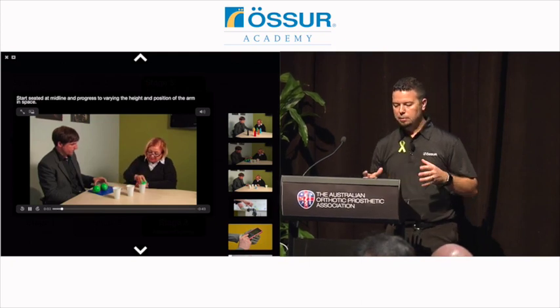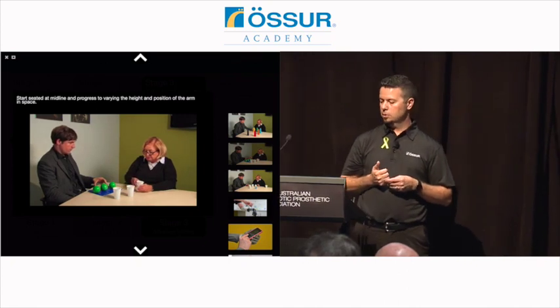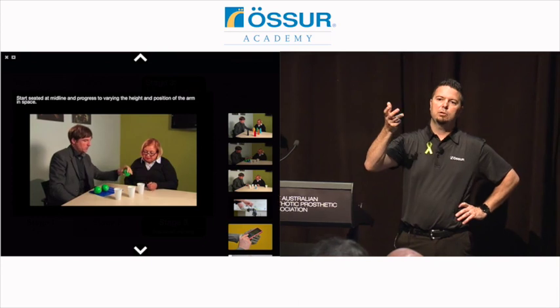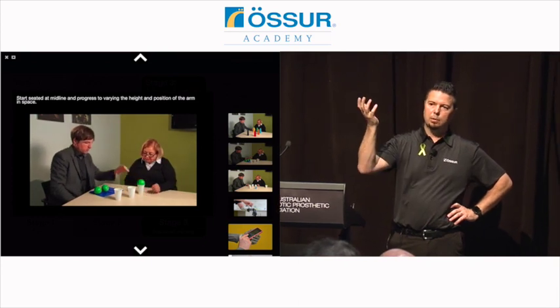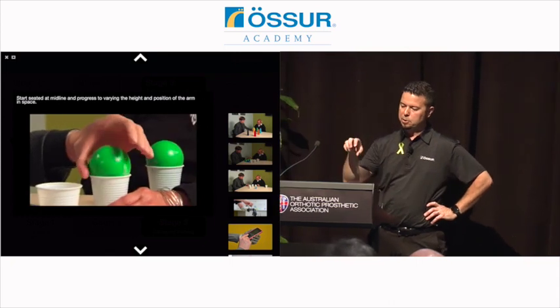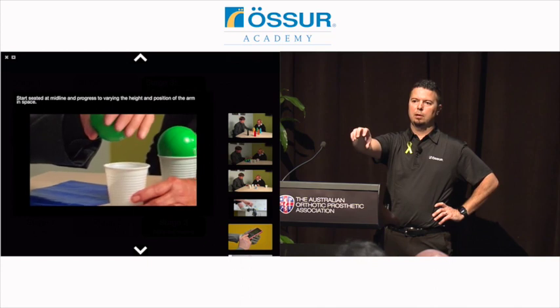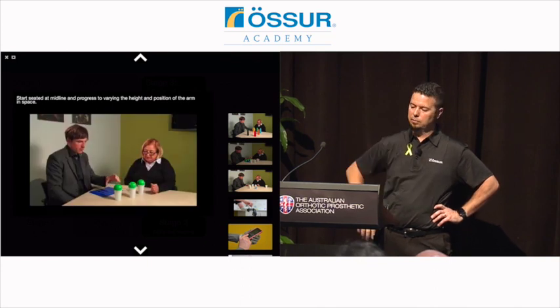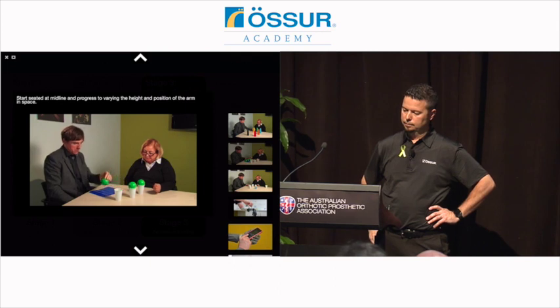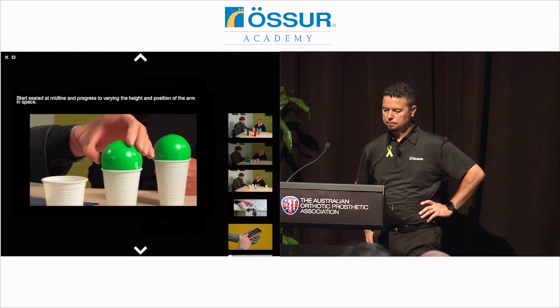And here we're just varying the height and position of the object. In this one, we're just using that soft ball. It's a good way to start with proportional control, because if he crushes the foam ball, it's not the end of the world, right? It's not going to hurt anything. But he can get a feel for how much pressure he applies and then vary the height without either opening or squishing it even more. And then pulling him back as well.